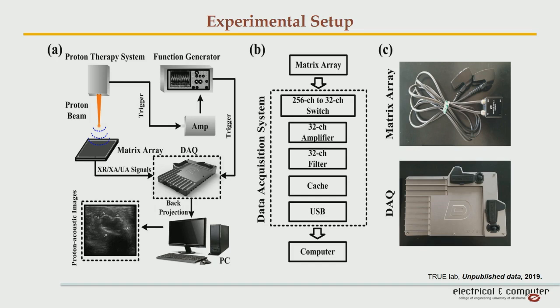We spent more than a year to build the system, all the way from transducer to the amplifier to the data acquisition system. We already tested with laser, so we can easily test it. It's working. We are really trying to just get good data from clinic. You know that our clinic is very, very busy. They treat patients from the morning all the way to midnight, and it's hard to find a time window to acquire this data, but we're trying our best to get good imaging from that.